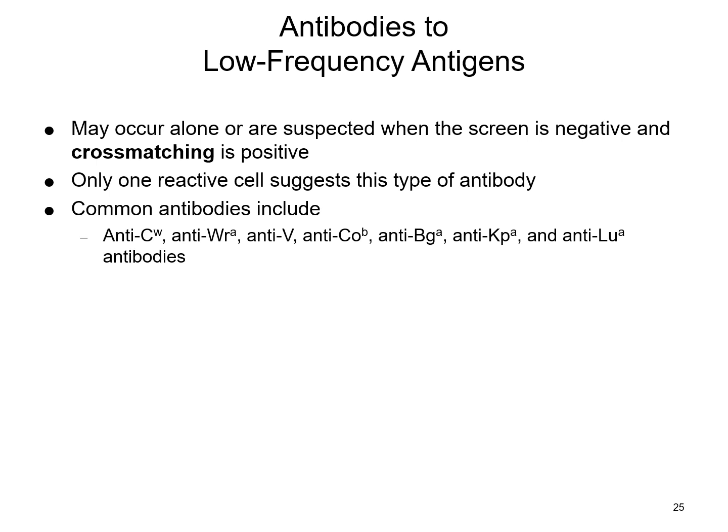Antibodies to low frequency antigens. Now these are fun as well, because you could run your screen, it's negative, and then you go do your cross match and you get a positive reaction and you can't figure out what happened. So you're repeating everything, and then come to find out you have a low frequency antigen. Anytime your antibody screen's negative but then your cross match reacts, you want to do a little bit of investigation.